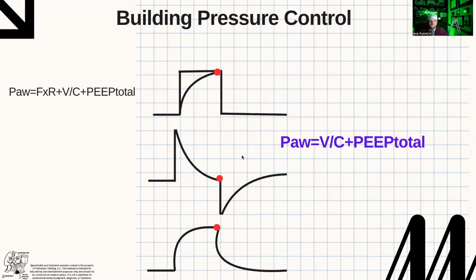And most of the things that are wrong with mechanical ventilation hinge on the fact that we don't take into account that if there is still flow at the end of the breath, there's still a delta pressure. Now, that could either be because the patient's breathing, so they're interacting with the ventilator, or it could be because of your settings. So the I time is too short or something like that, right?